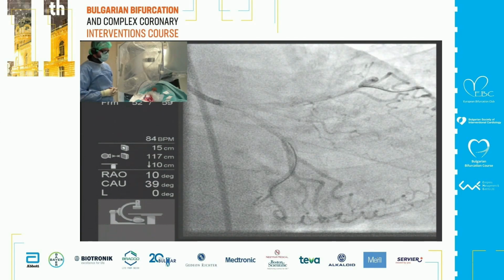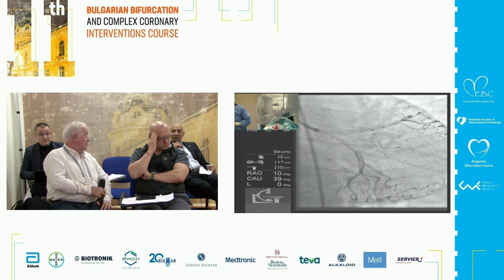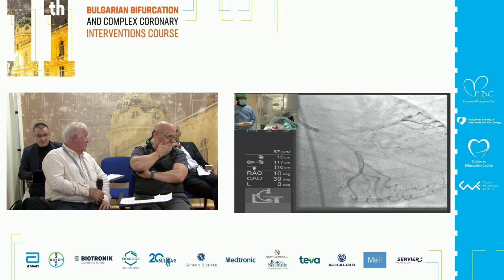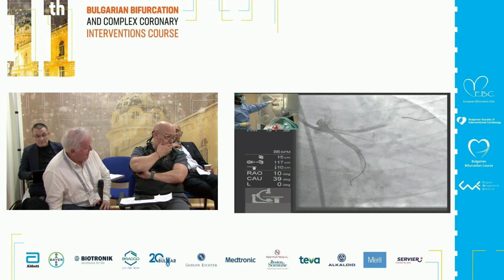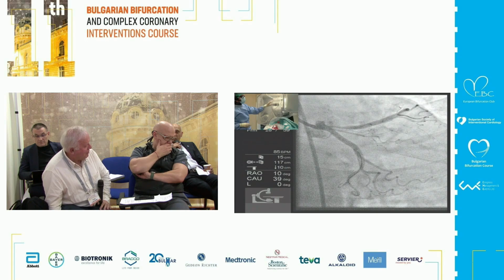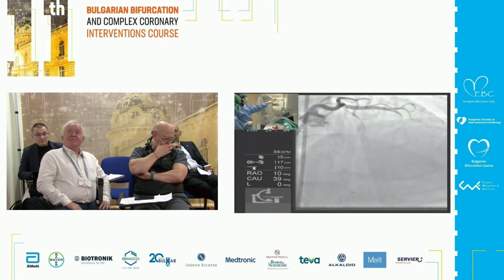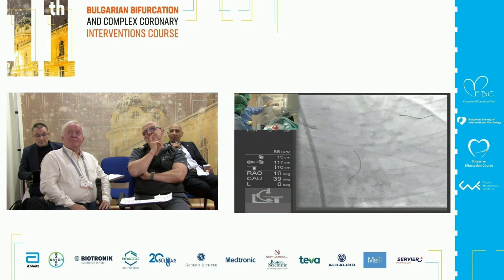George, you bring up a very interesting point. At the Cleveland Clinic, we use ultrasound guided access for arteries and veins very, very commonly. And though we haven't published it, I personally have experience of occluded radials, no pulsatility at all. But on the ultrasound, you can visualize the radial artery with thrombus inside. You can access it, you can get distally, and amazingly, after the procedure is done, you've done some kind of Fogartization of the radial, and the radial pulses back, because very often it is thrombotic, not fibrotic. Yeah, you're right on that.